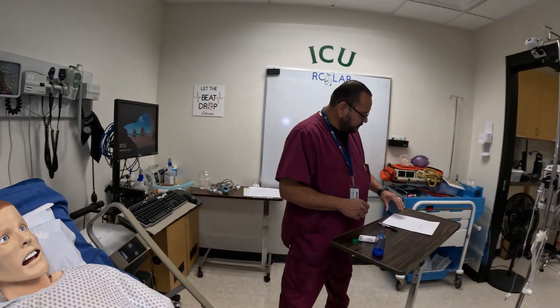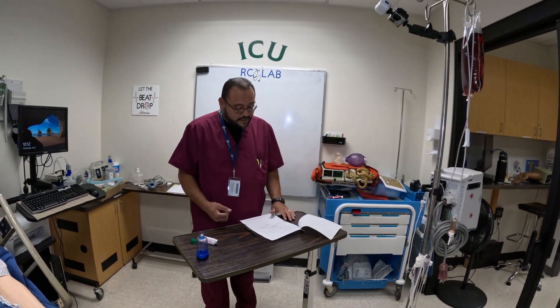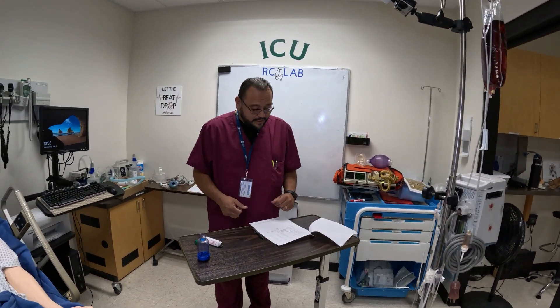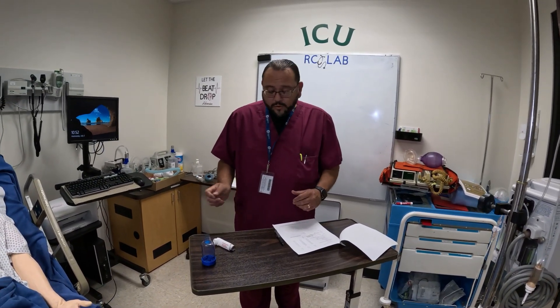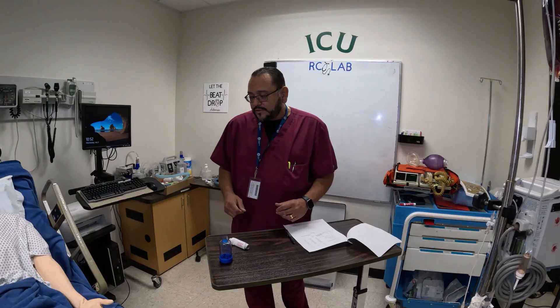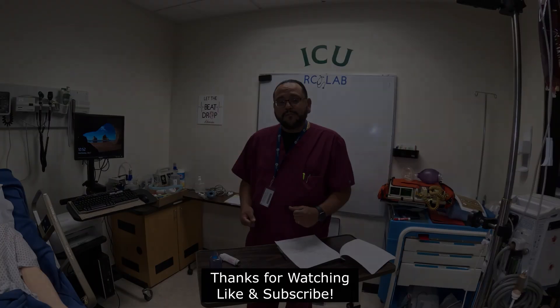After you're done, go ahead and clean up, thank the patient, take the medicine outside and put it back in the patient's bin labeled, and then record your procedure and everything you did into the chart document. Thank Mr. Smith, ask him if there's anything he'd like done before you leave, and let him know if you're coming back for another treatment. Thank you.